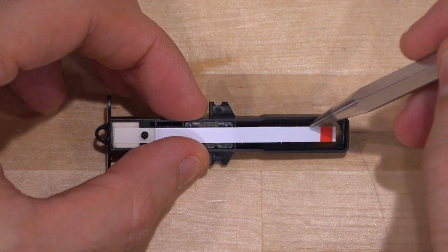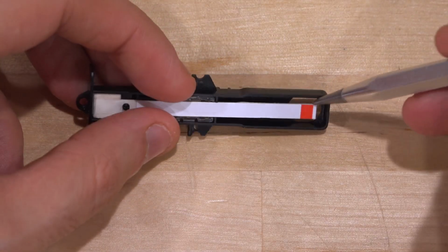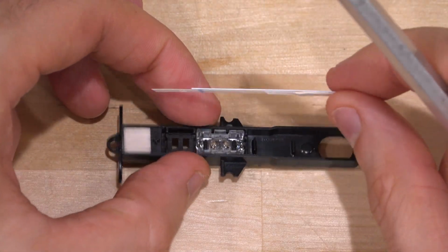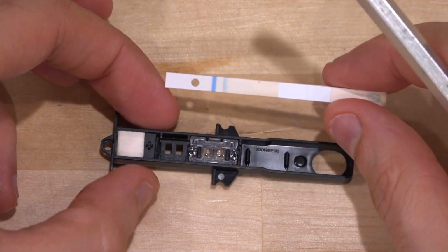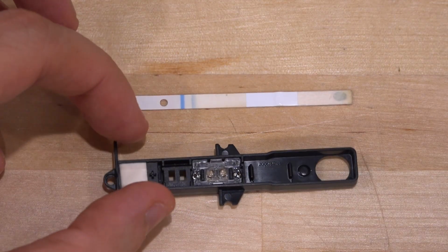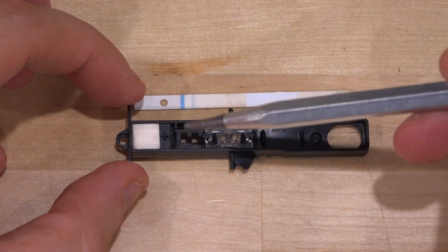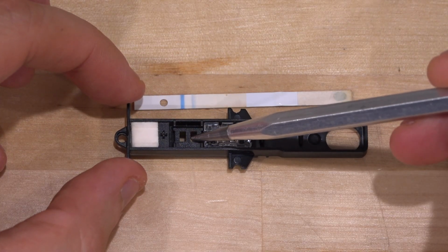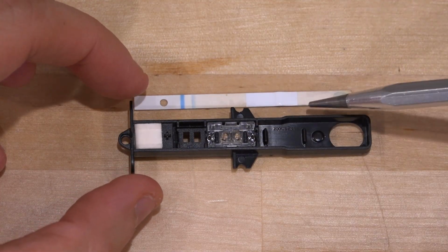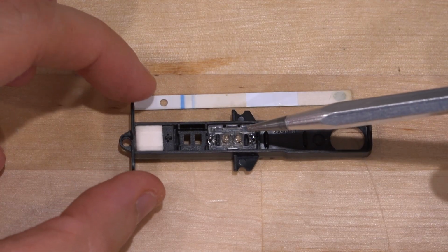So if you drop the liquid on this side, you should be able to see the lines on the other side. Does this come off? Yep, it does. There we go. Interesting. So this one does have two lines on it. I wonder if that's the positive nature of it, but that's unusual because it lines up with these two. So does that mean that these are the results and this entire section is some kind of a control or the monitoring of the fluid coming up? Seems like a lot of optics for that.